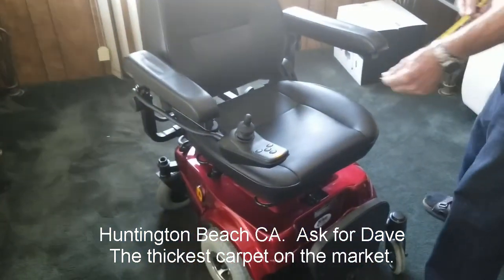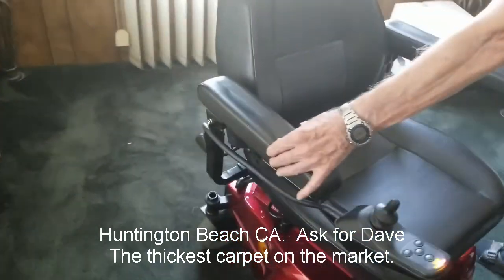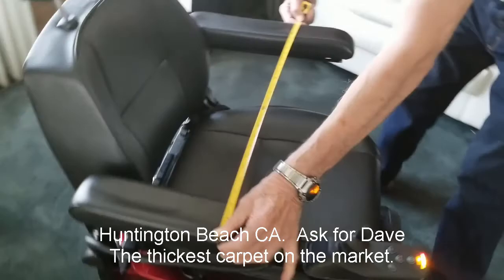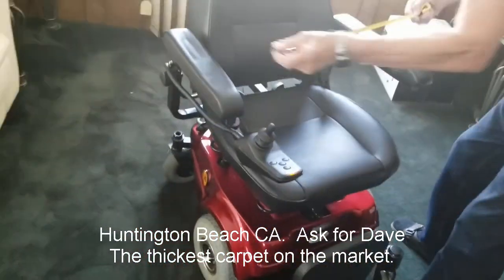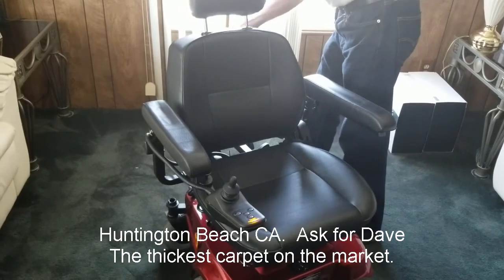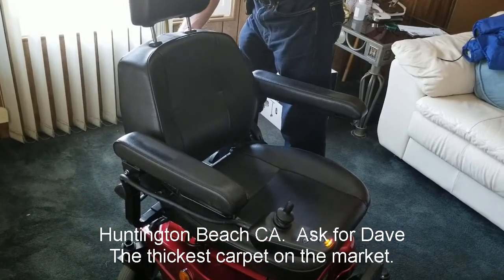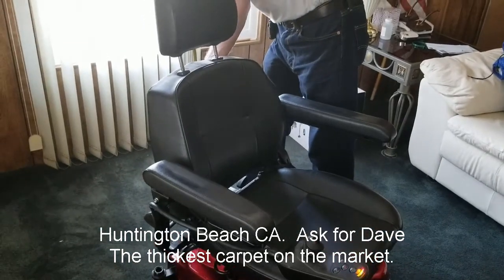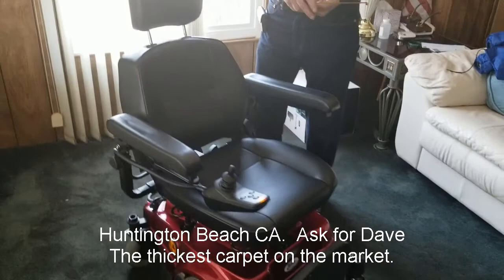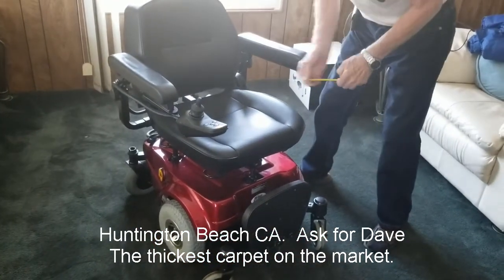This is a wheelchair that we're selling on Craigslist. We're taking certain measurements at this point. It's 27 inches wide. We have a wheelchair here — it's 27 inches wide. The height is 44 inches high. What's the maximum weight capacity? I think it's 400 pounds. Yes, the maximum weight capacity is 400 pounds.